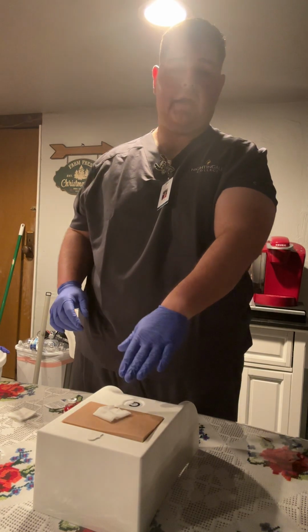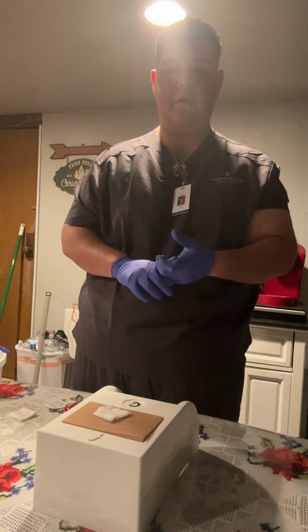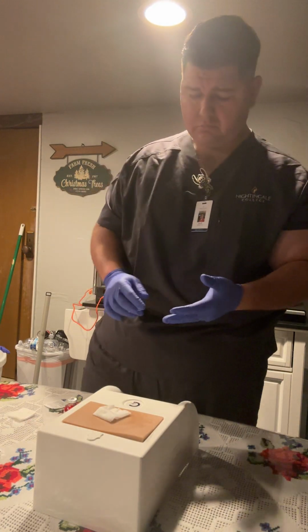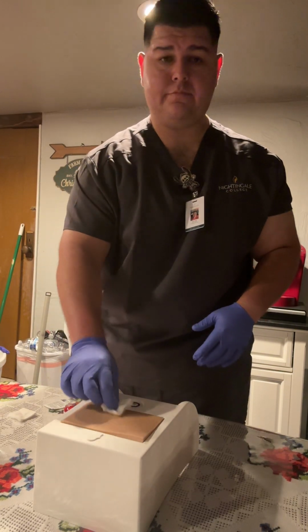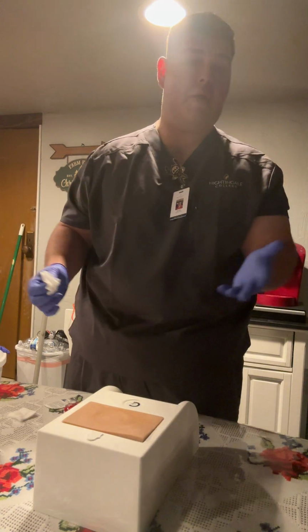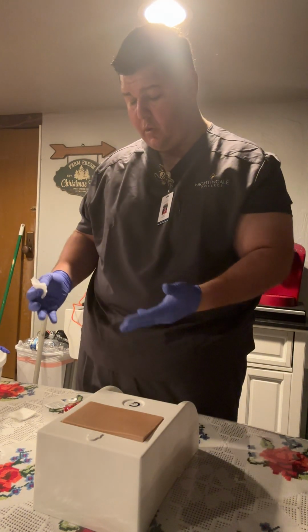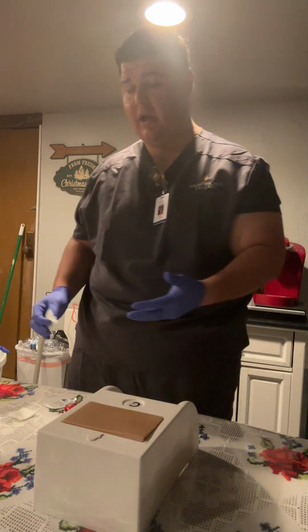Going back to the site of injection, I want to make sure I don't rub or massage the site, but I do want to check on it, make sure there's not any bleeding or anything abnormal. For this case, there's none. So no need for a band-aid. There's no blood. I can go ahead and proceed to start cleaning up and dispose of the remaining items.